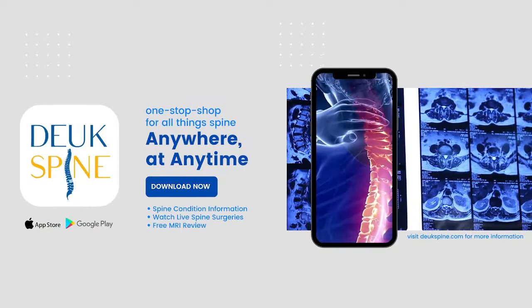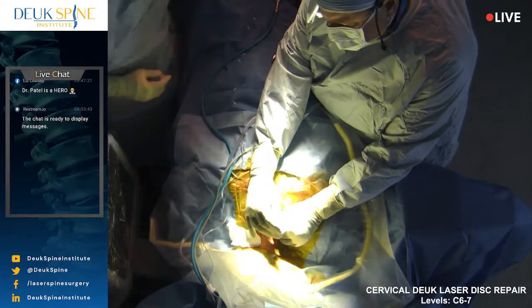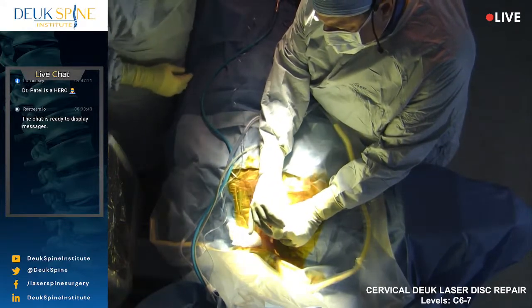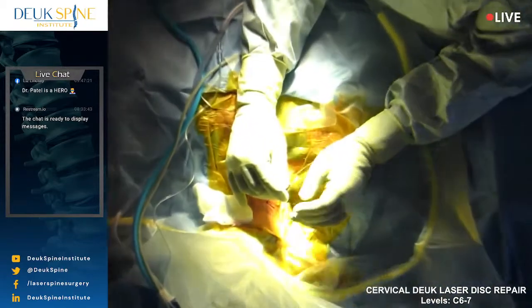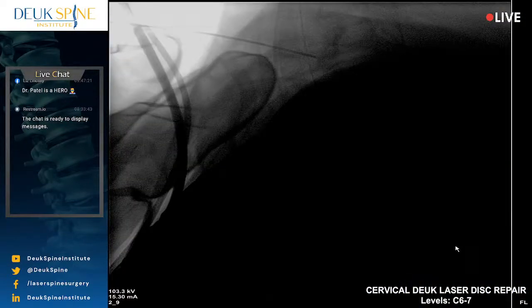All right, Dr. Deukmedjian, we're just starting to gain access to the front of the spine for a Deuk laser disc repair. We're sitting on a bone spur that's just in the front of the spine with my needle. Normally I'm inside the disc at this point, but I'm gonna have to try to, don't do anything, just hand me the dilator. I'm gonna have to try to bring the dilator down.